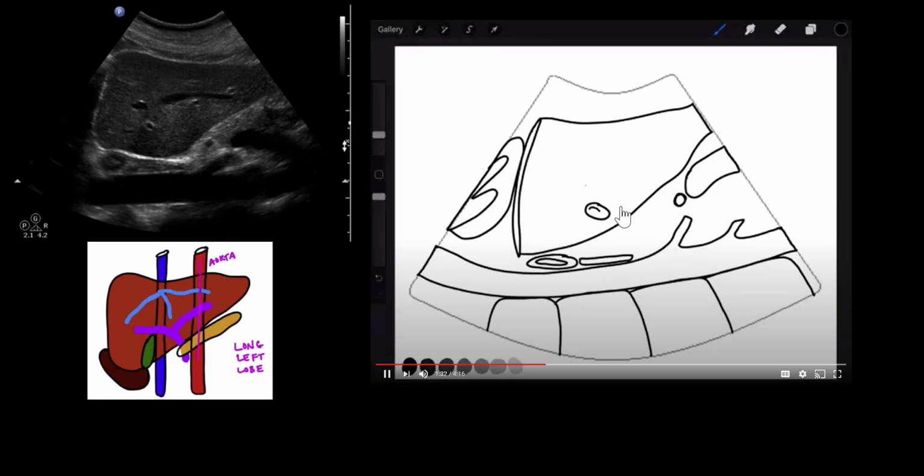and inside the liver we can see some structures that have bright, thick walls. These are going to be portal veins, or sections of. And then we can see other structures that appear to have thin or isoechoic walls, which typically represent hepatic veins. So let's go ahead and label our picture again, starting with the heart and the superior portion of our image, followed by the diaphragm moving inferiorly.